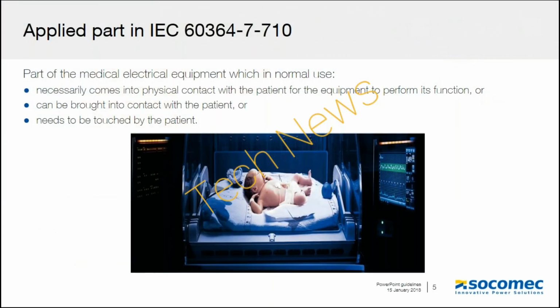The first important terminology in the IEC standard is what is known as the applied part. The applied part is the part of the medical electrical equipment which, in normal use, necessarily comes into physical contact with the patient for the equipment to perform its function, or can be brought into contact with the patient, or needs to be touched by the patient. So in this picture here, on the baby, the sensor is the applied part.